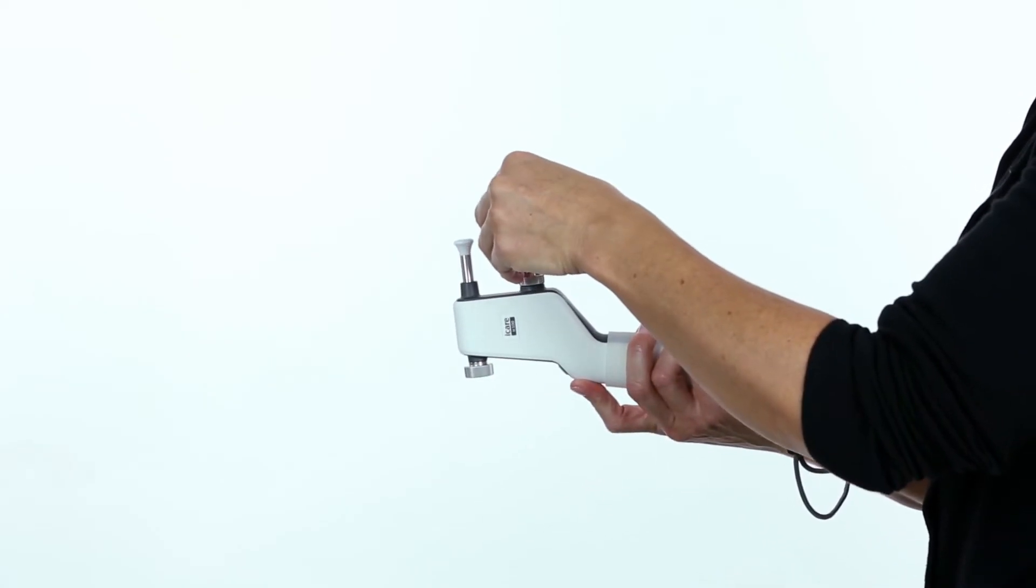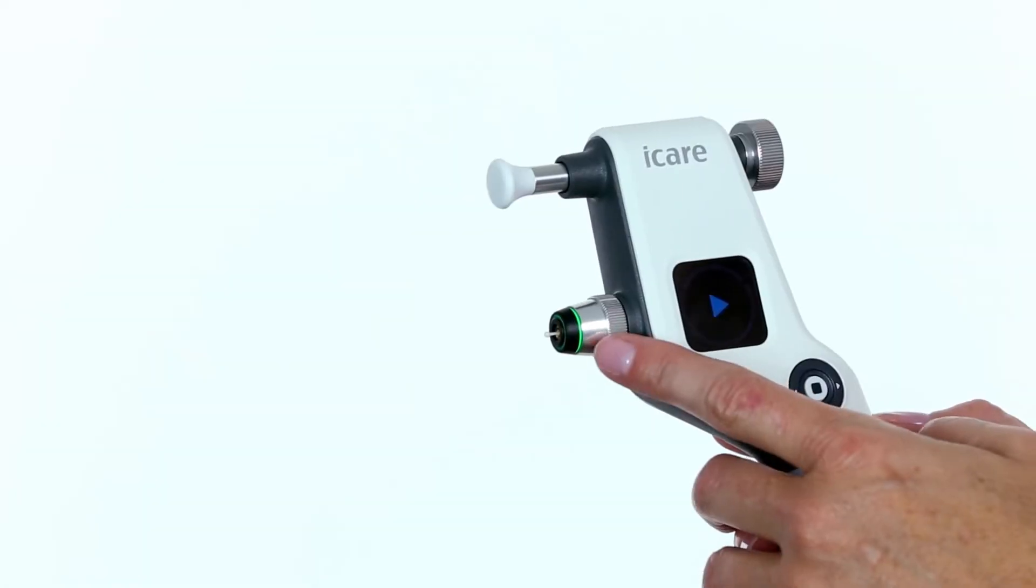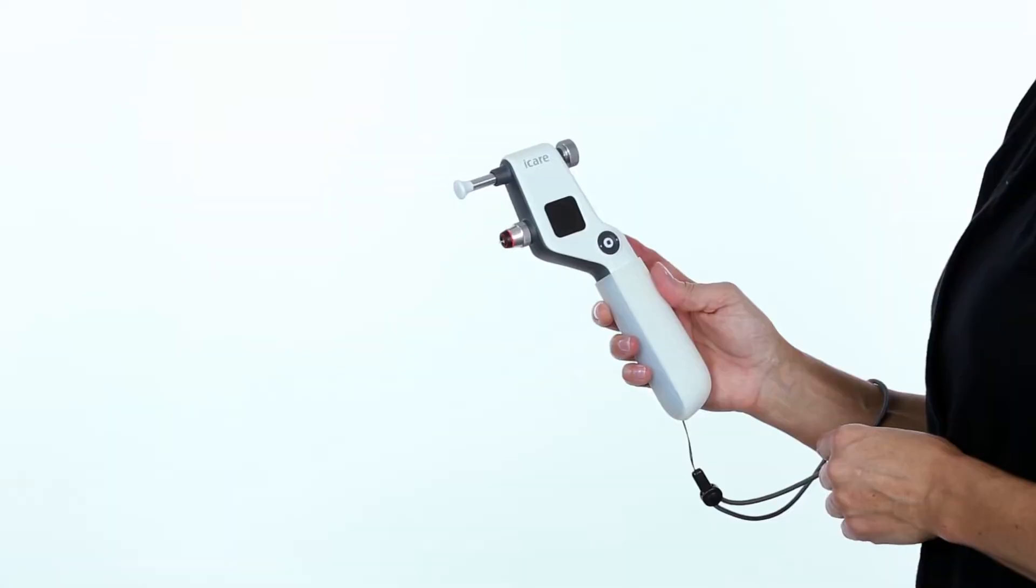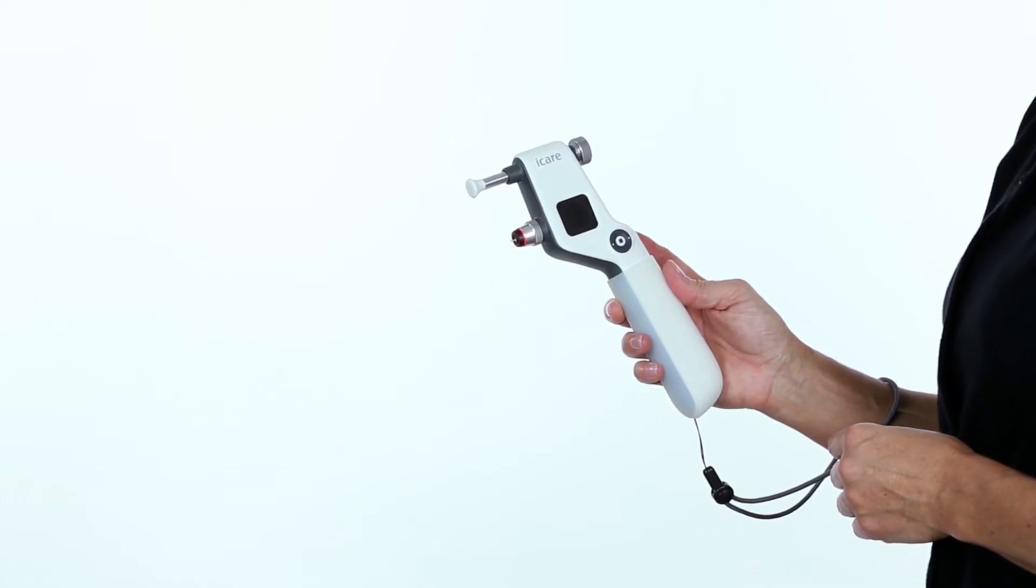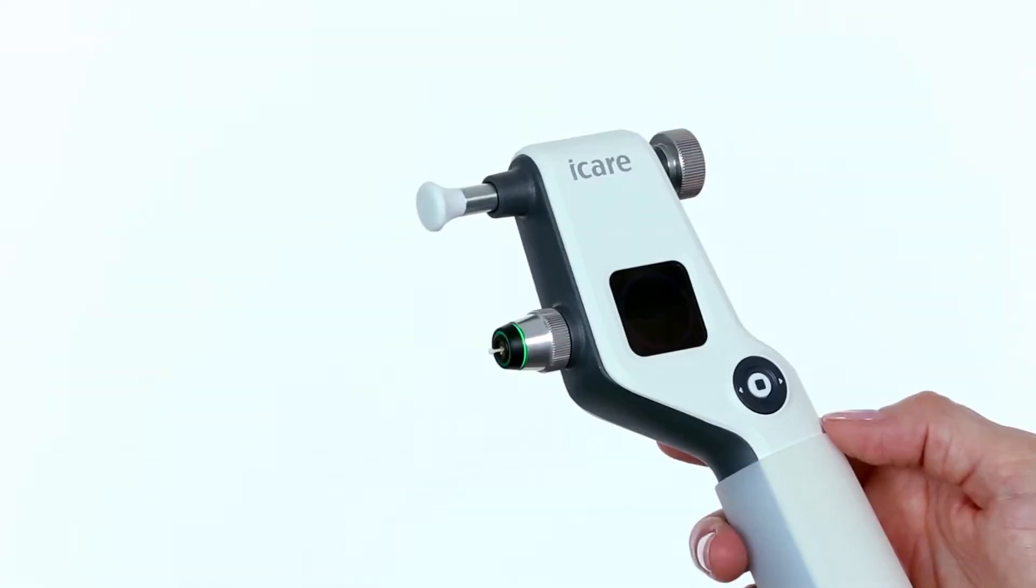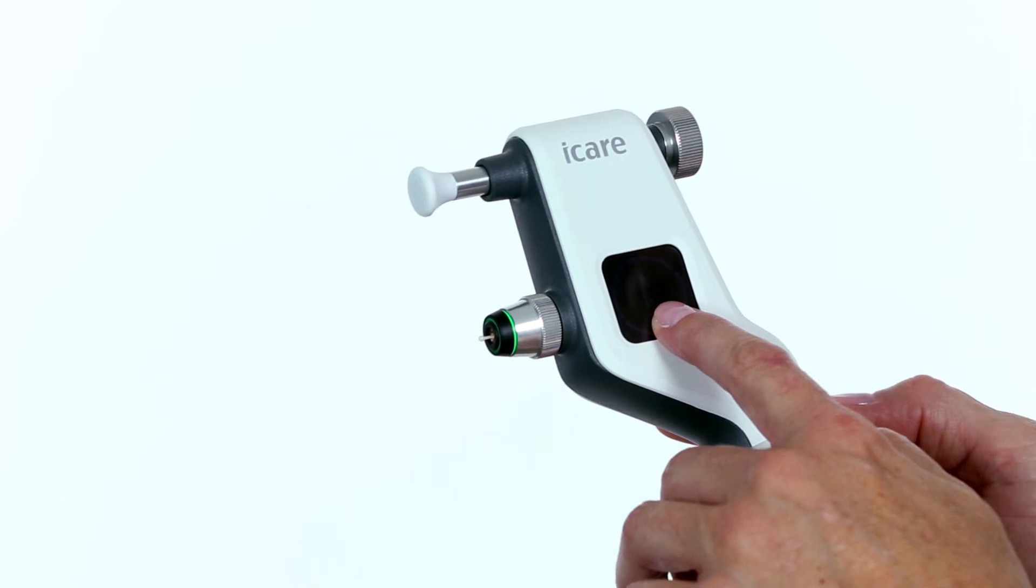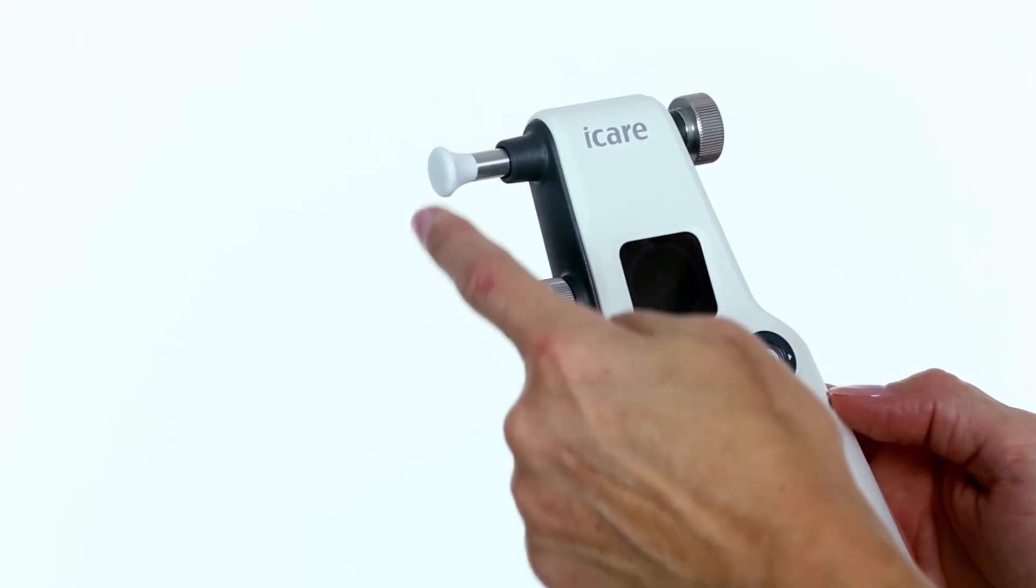Once the probe has been inserted into the tonometer, a green or red light will be visible around the probe base. The probe will automatically magnetize and it will not fall out. The tonometer is ready to take a measurement when the blue play symbol appears on the display.